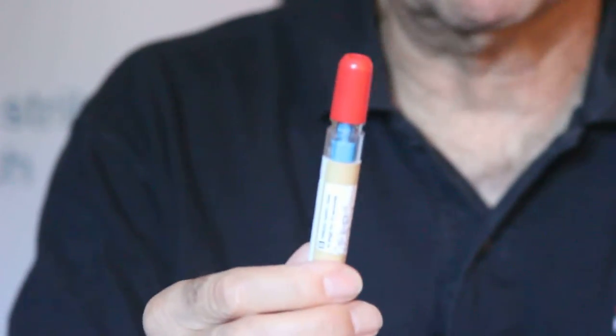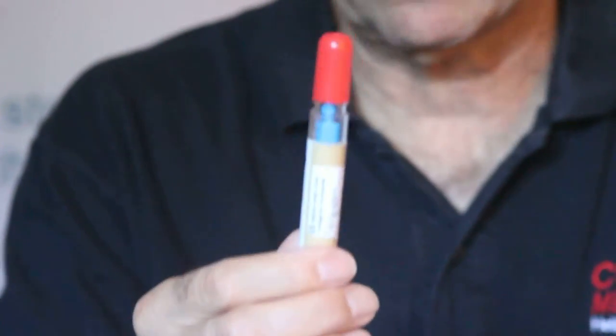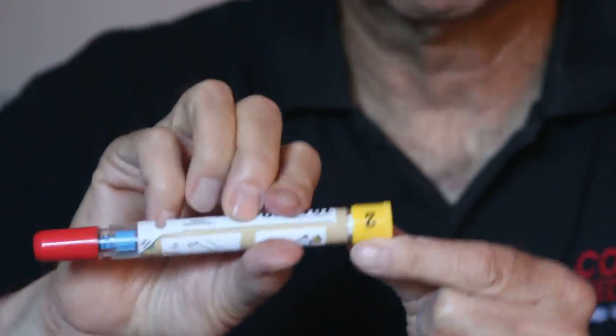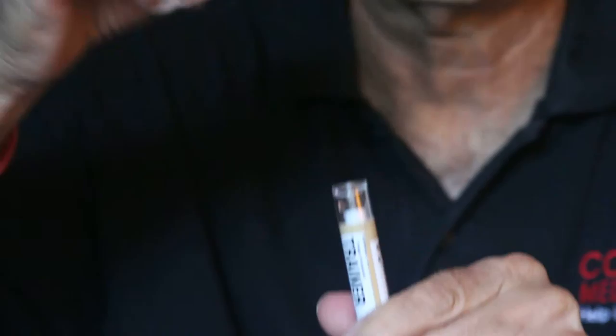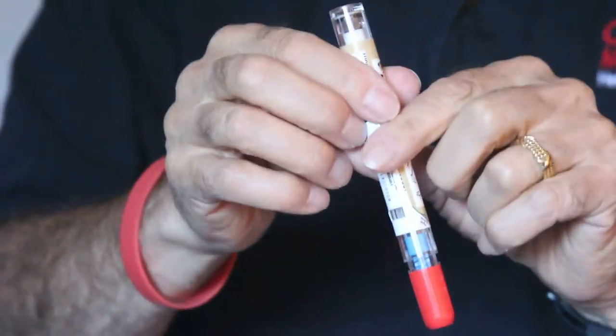But in a big muscle like the thigh muscle, where it's supposed to go, this is no problem at all. That's number one. Number two is indicated with the number 2, so we're going to pull this one off as well. Once they're off, this pen is ready to use.